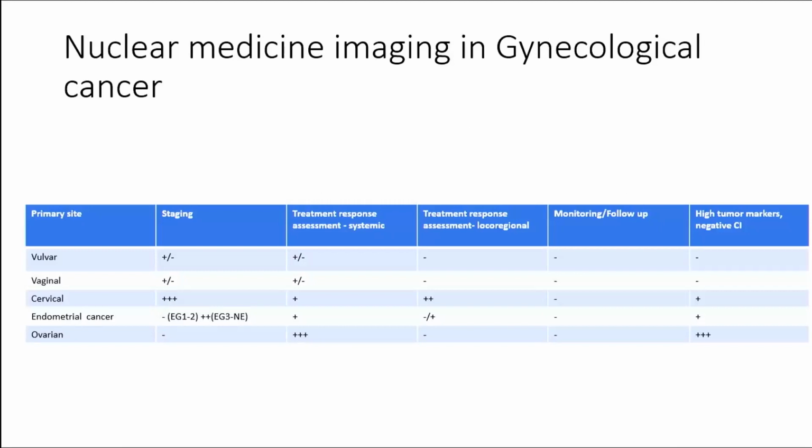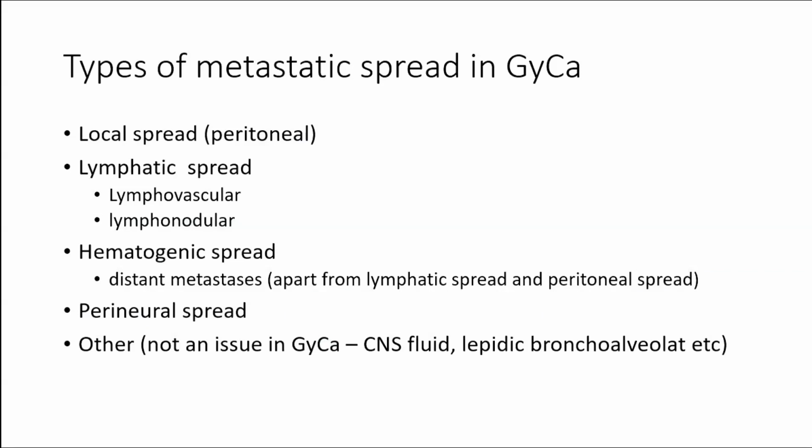So where's the place of nuclear medicine in imaging in gynecological cancer, if we want to focus on gynecological cancer? You can go through the NCCN guidelines and see it was not recommended probably 10 years ago. Now it's everywhere. On certain occasions it's underrated, on certain occasions it's severely overrated. I don't see a rationale to stage a patient with high-grade serous cancer with PET-CT. I see zero idea in that. It should be done surgically.